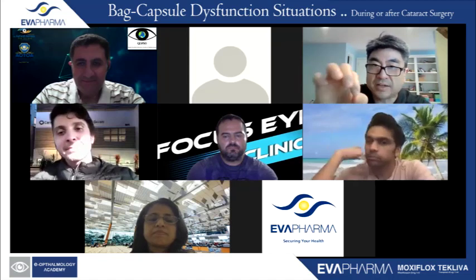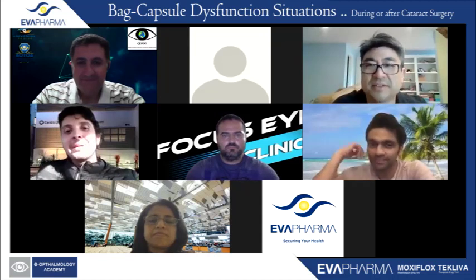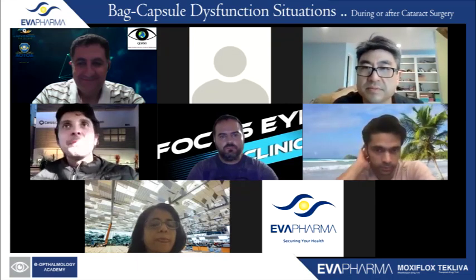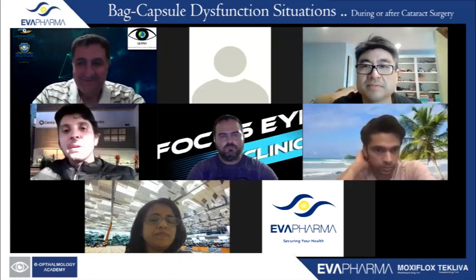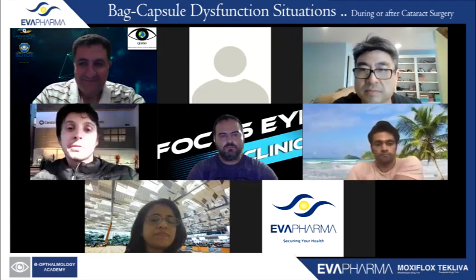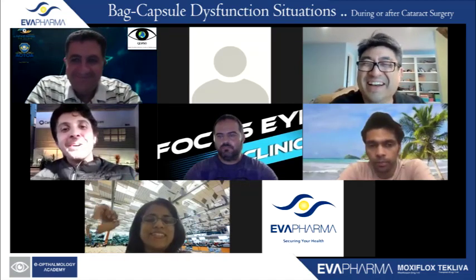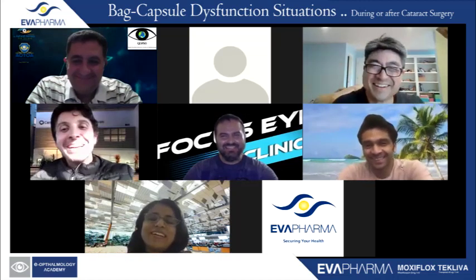Is your eyelet tilted? Yes. Yes, that's great. Yes, and there is an angle. There is an angle. Of course, it's possible to do it with an Ahmed CTS, but sometimes you have tilt. Sometimes you have tilt. Yes, sometimes. But if you have an angle in the arm, you avoid it. You don't have tilt, till now in my research. Is it available in the US, yours? No, only in India. You need to go to the ASCRS, but we understand.